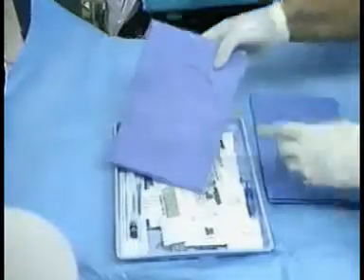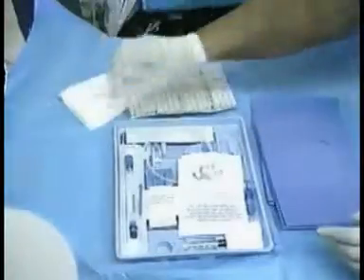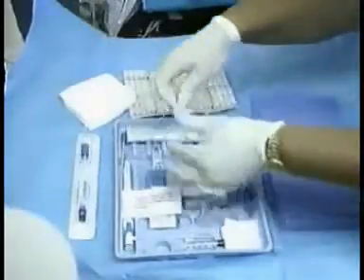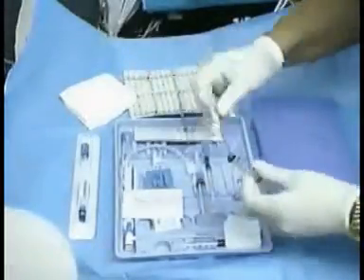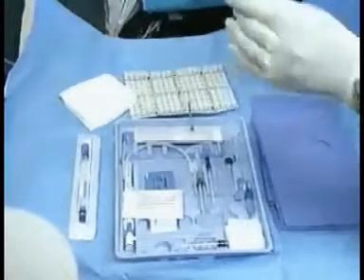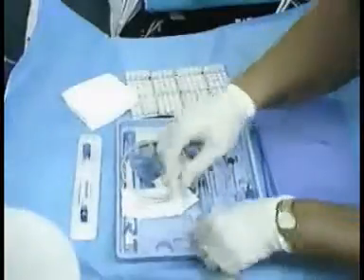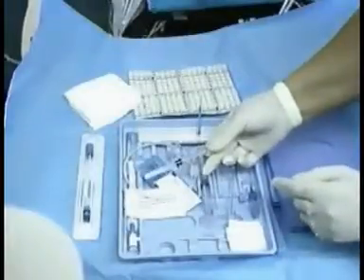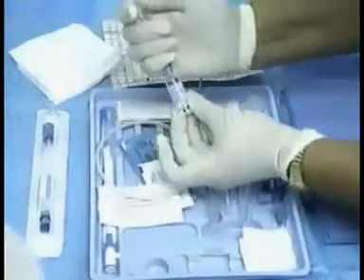The contents of the equipment tray include sterile drapes, sterile gauze, a flexible guide wire contained within a sheath, an introducer needle attached to a syringe, local anesthetic, and a smaller needle and syringe used to inject local anesthesia. Fill the syringe with lidocaine.